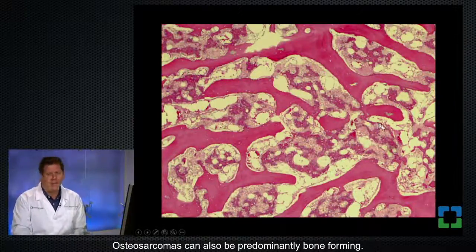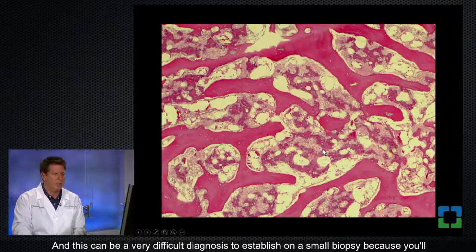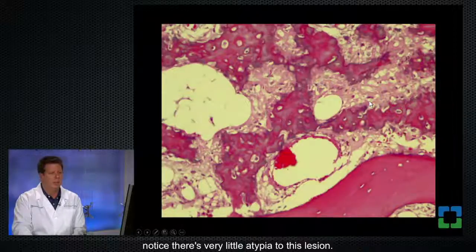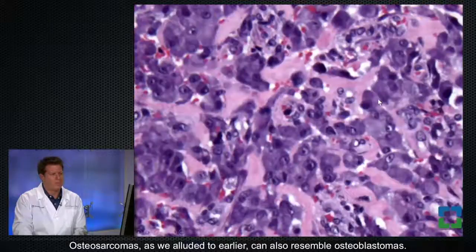Osteosarcomas can also be predominantly bone forming. This is the native bone in the patient here, and the tumor, as you see here, is producing large amounts of bone and permeating or infiltrating the adjacent bony trabeculae. And this can be a very difficult diagnosis to establish on a small biopsy because you'll notice there's very little atypia to this lesion. These osteoblastic or sclerosing osteosarcomas behave just as aggressively as the more atypical types of osteosarcomas.